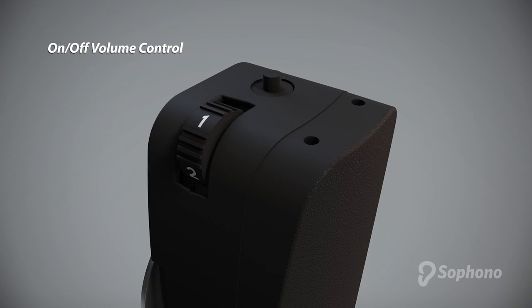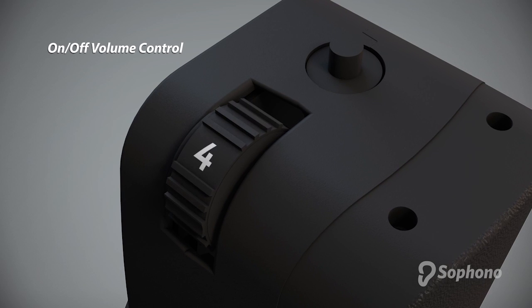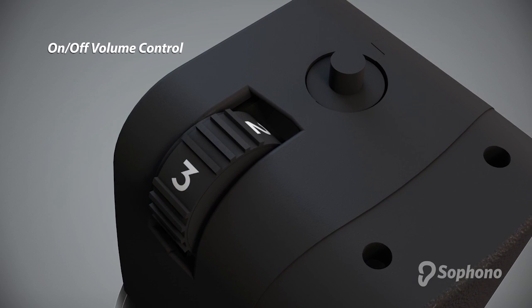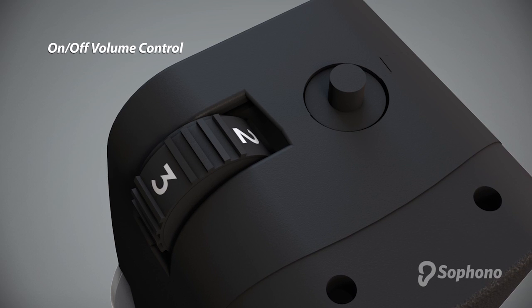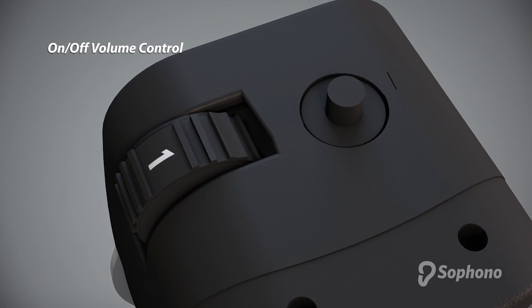The volume wheel is also the on-off switch. Turn the wheel all the way up to four and then adjust it down to a comfortable loudness. Turn the device off by rotating the wheel all the way down past the number one. You will feel a click when the device is off.